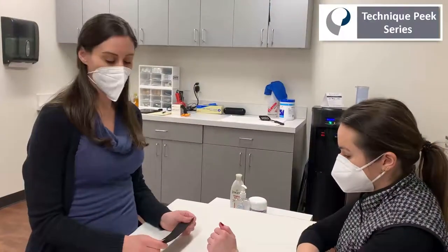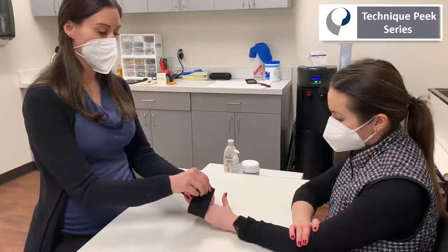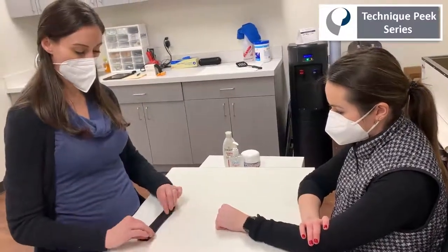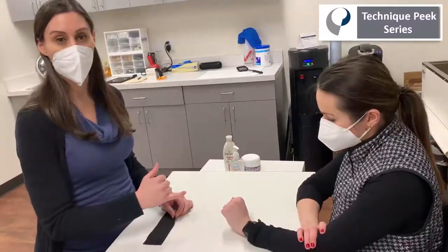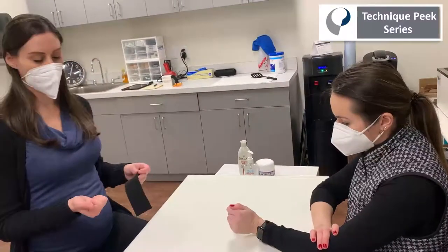The material I'm going to use is the Orpheas — this is the six centimeter. What you want to do is cut it to the circumference of the hand. Once I pull it out of the water, I'm going to fold it into thirds, which is going to give the splint stability and also make sure that it's the size of the proximal phalanx, so that she is able to bend the PIPs and the MP joints.